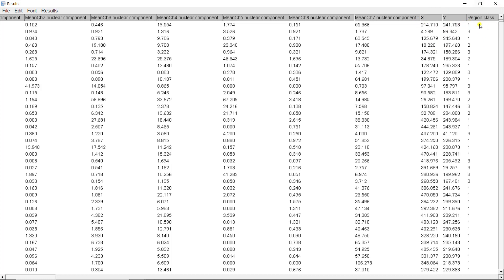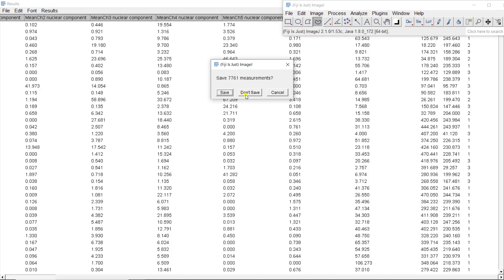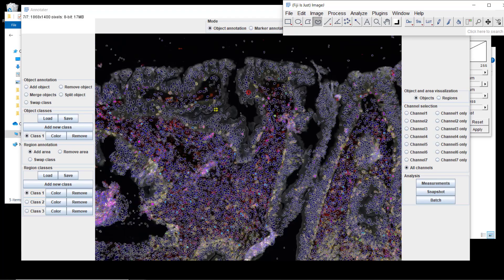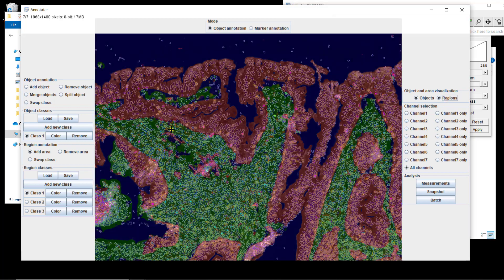And finally, we have the region class: one for epithelium, two for stroma, and three for background — in the same order as they are defined. We have almost a thousand nuclei in this image that were segmented. So class one is in red (epithelium), class two is in green (stroma), class three is in blue (background). That covers the part where we consider regions and object annotations.